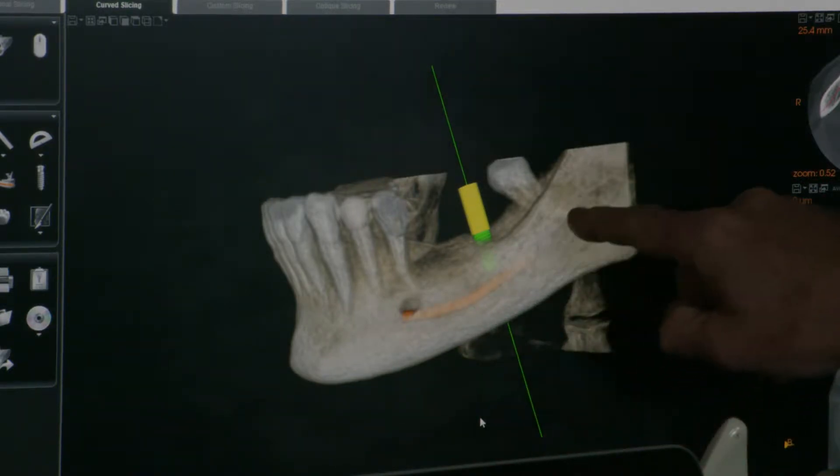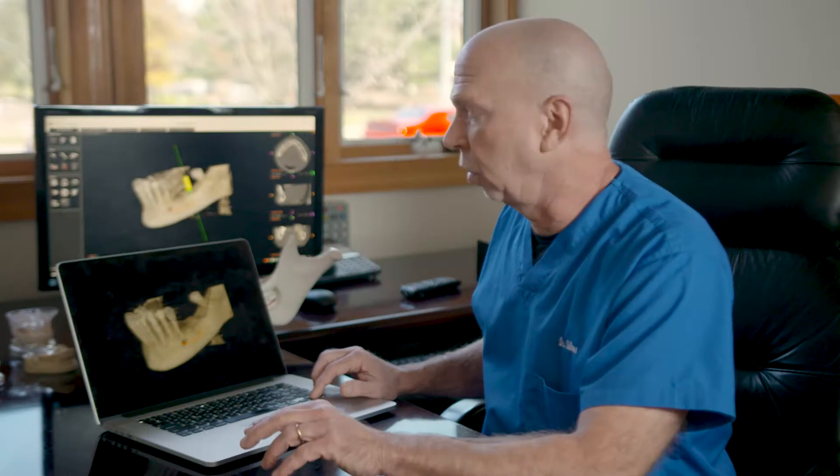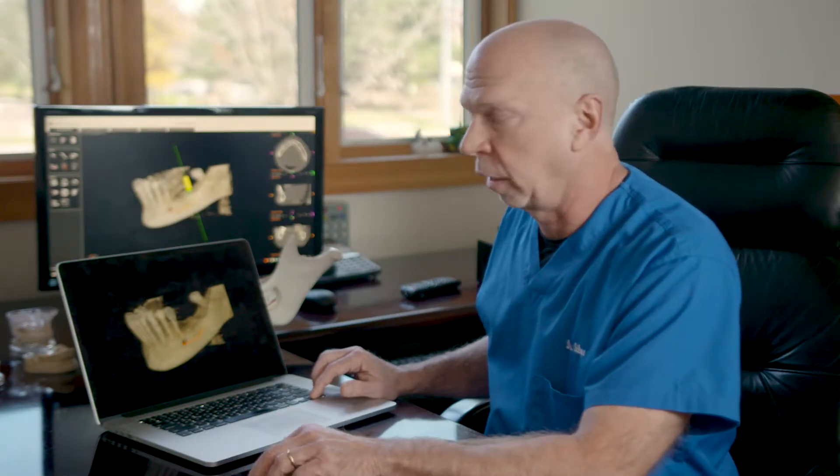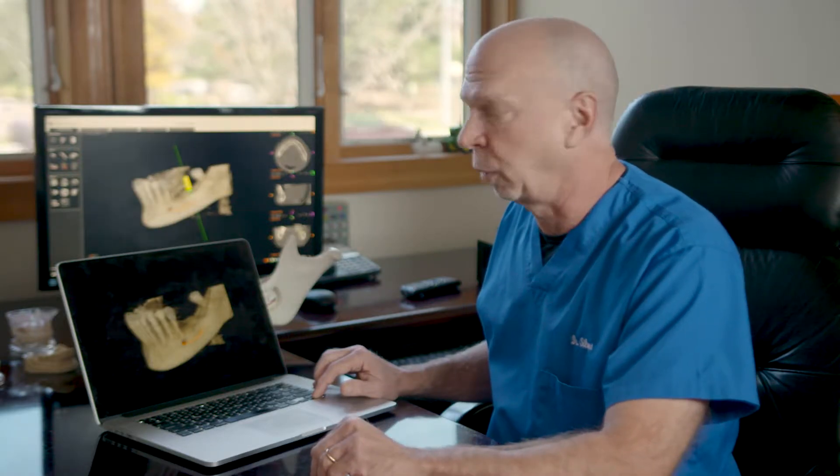We plan using our dental implant software exactly in space where we want her new tooth to be. So this is all driven by the best location for the replacement tooth.